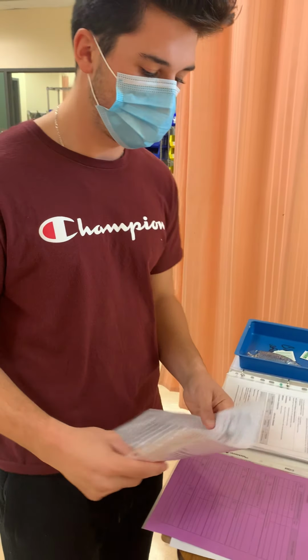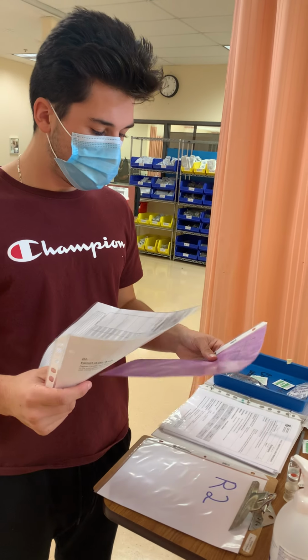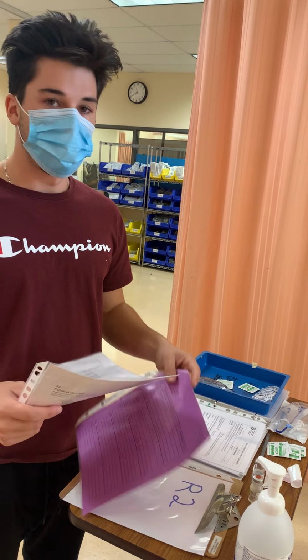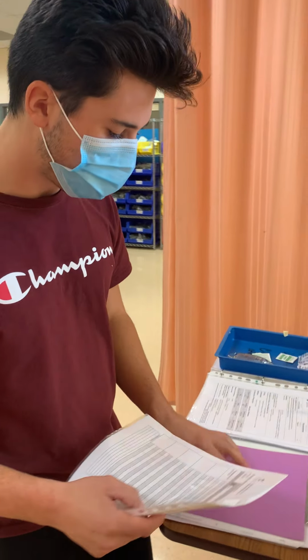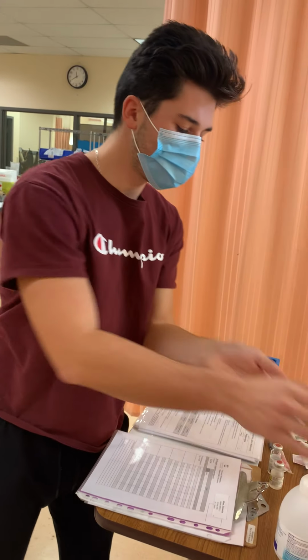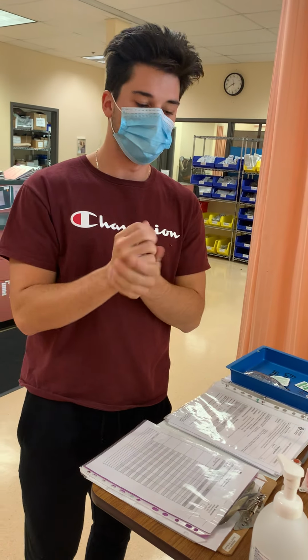To start off, I'm going to be comparing my physician's orders to my MAR, and I can see that they both match, and that there's a primary of normal saline already running. Once I've compared them, I can go ahead and perform hand hygiene quickly, and I can grab my medication from the Pyxis machine.